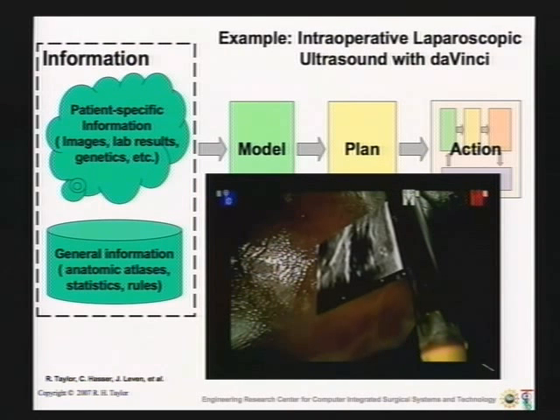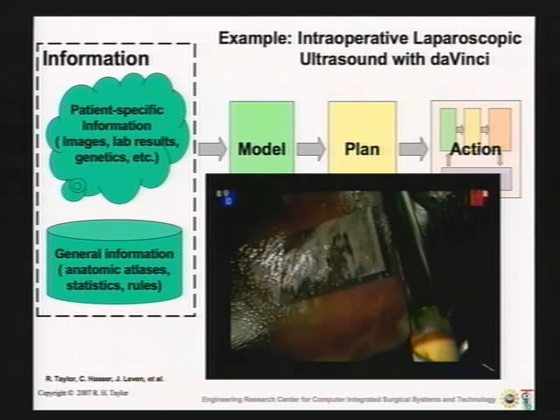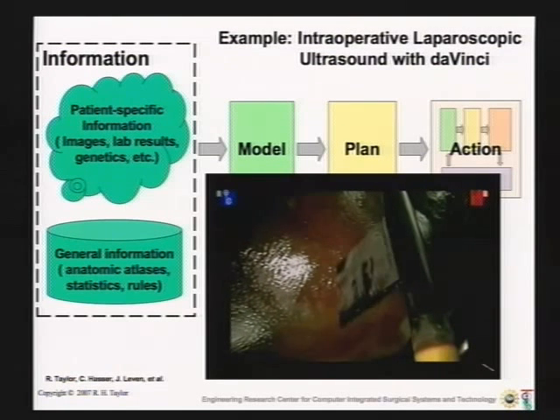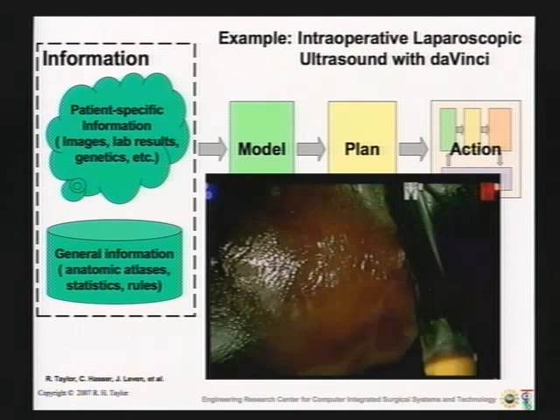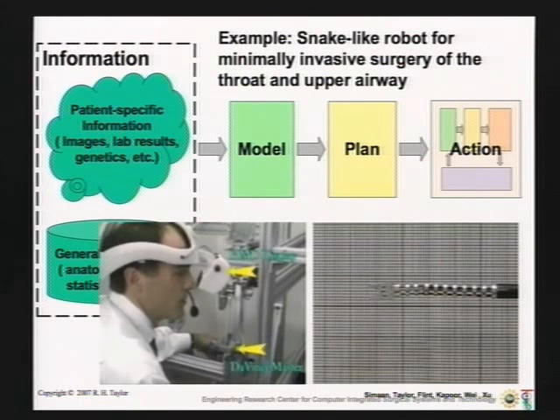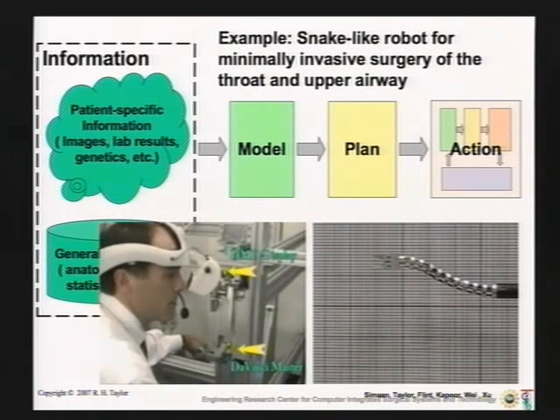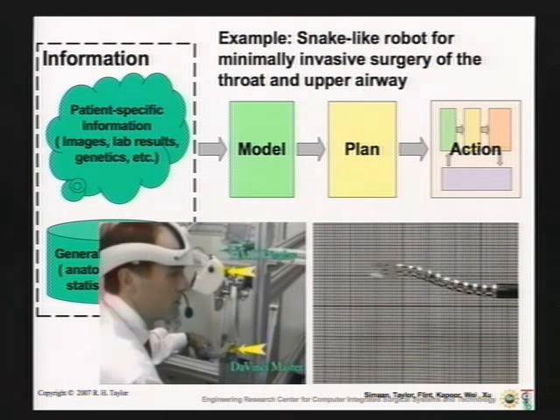One of the other projects we have with Intuitive is to equip the Da Vinci surgical robot with a laparoscopic ultrasound probe. This is from phase 1 of the study with a rigid laparoscopic probe. And again, this is just simply showing the ultrasound flashlight mode, quite similar to what you've been doing for lo these many years. Although we now have a wristed probe, and we're looking at a lot of alternate ways of presenting the ultrasound information.